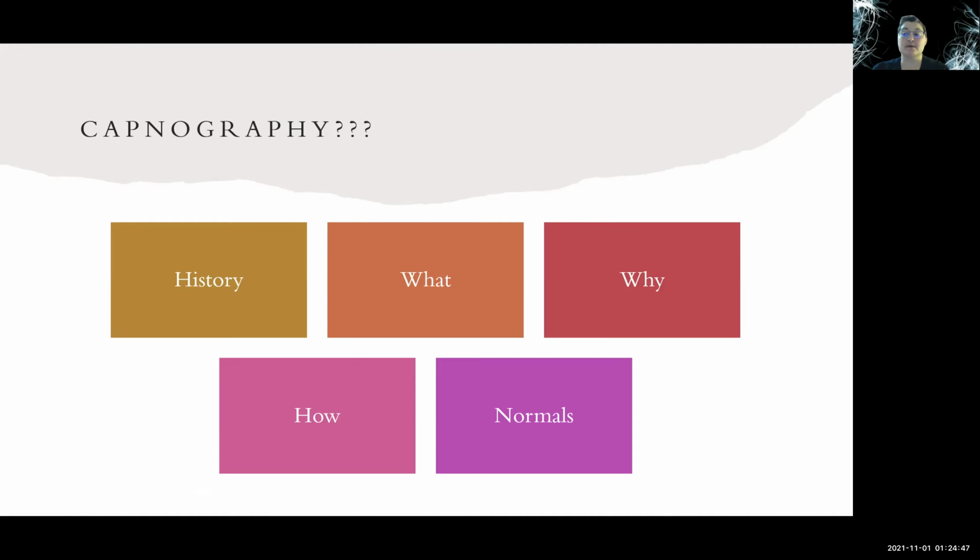It's going to provide information about CO2 production, pulmonary perfusion, alveolar ventilation, respiratory patterns, even how well the body is eliminating that CO2. Now, when CO2 is dissolved in plasma and measured by blood gases, it's known as the arterial partial pressure of carbon dioxide, or PaCO2 with a lowercase a.